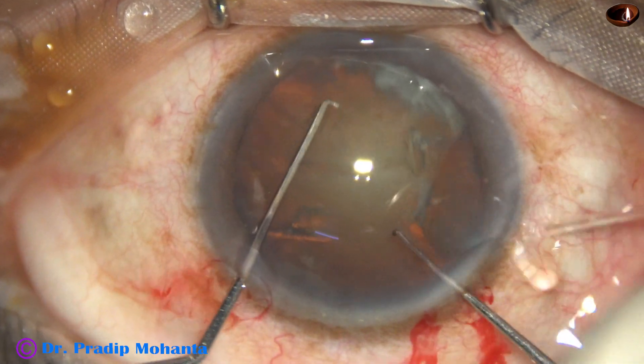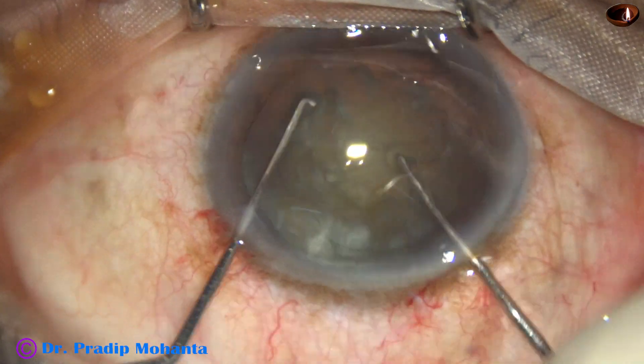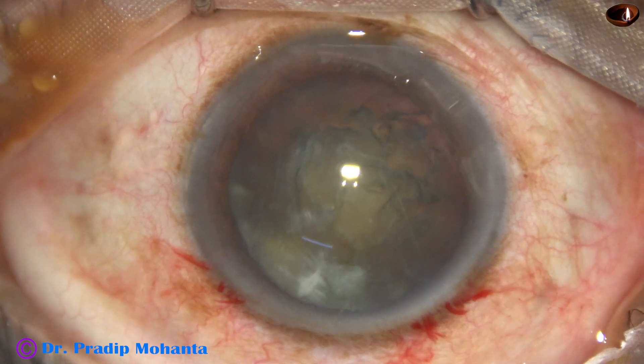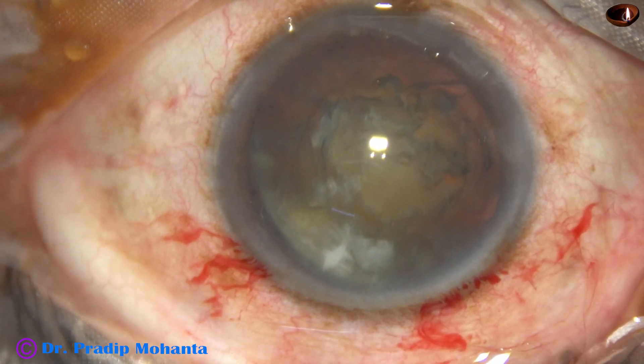Now this is bimanual rotation of the lens. If we rotate the lens bimanually, the stress on the zonule is much, much less.